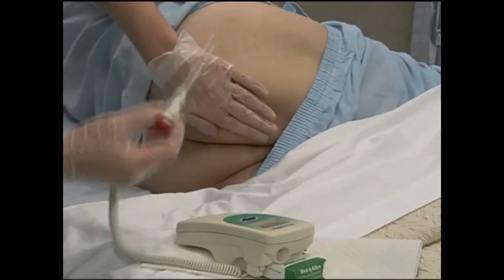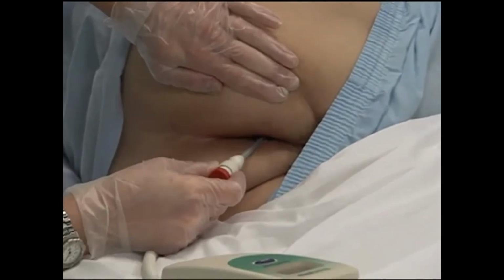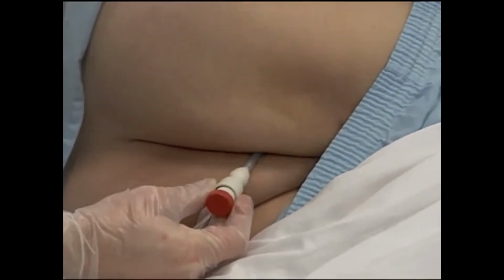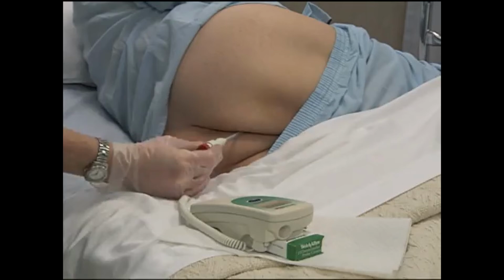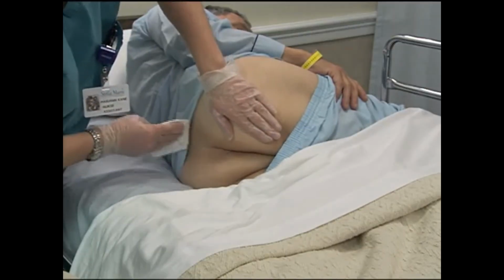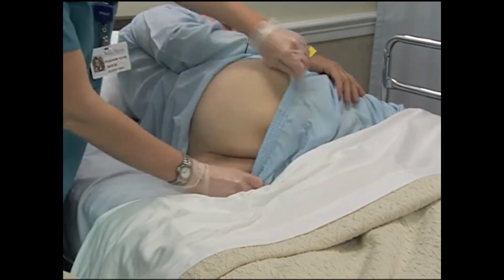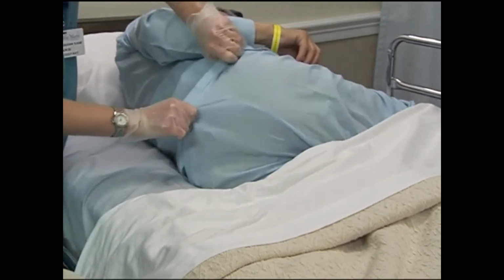Insert the probe into the client's rectum. For adults, about 2 to 3 centimeters or 1 inch. Hold the device in place until the device beeps. Use a tissue to remove remaining lubricant from the client, then see to his comfort. Dispose of the cover, then note your reading.